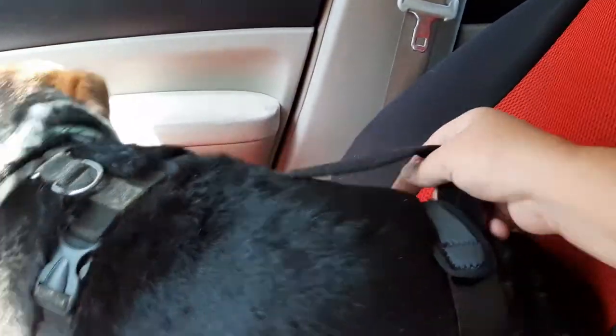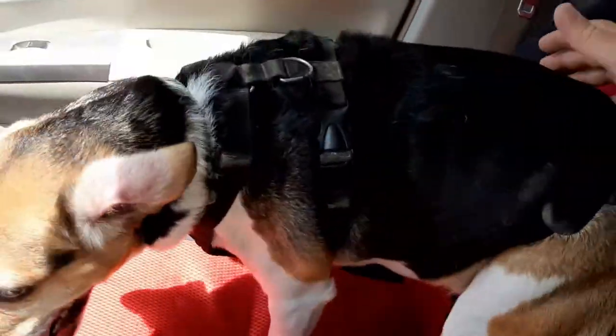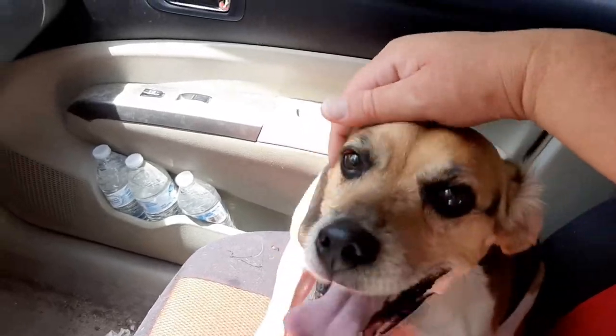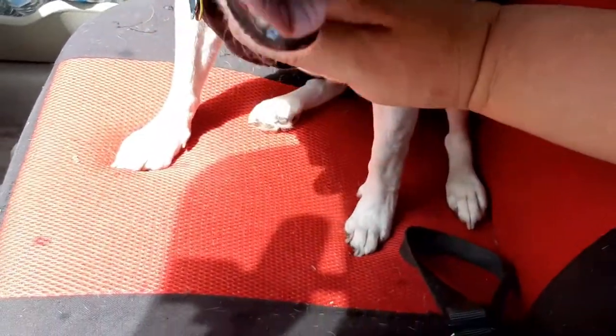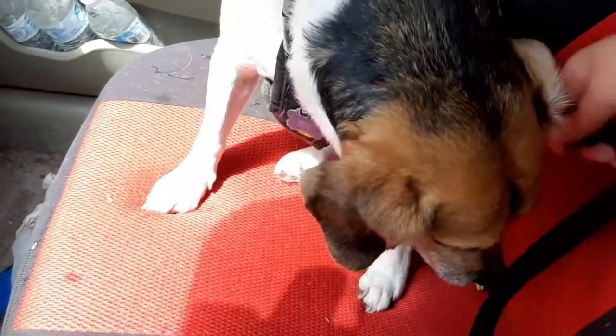I was trying to get a video of him walking but this strap here kept sliding down, so I had to make it a little bit tighter. When he sits down you can see he kind of sits funny — but he was actually walking better.